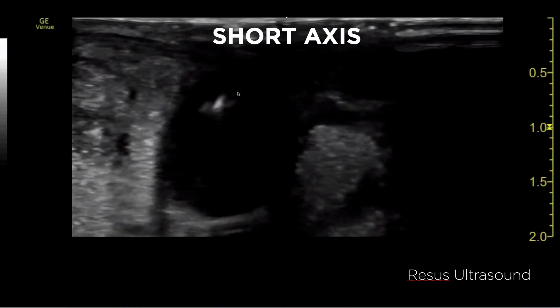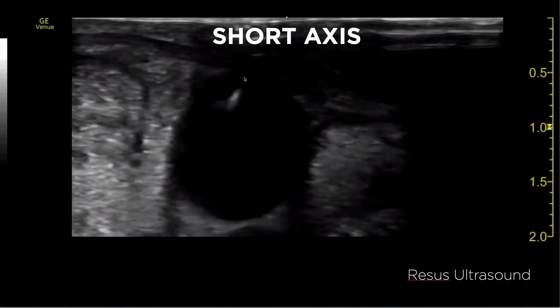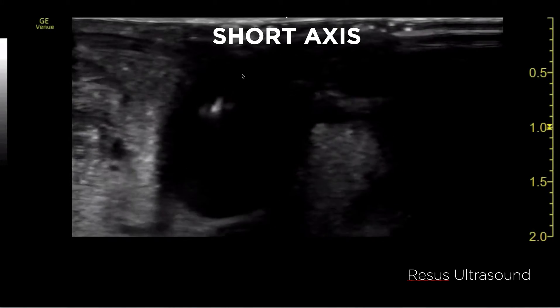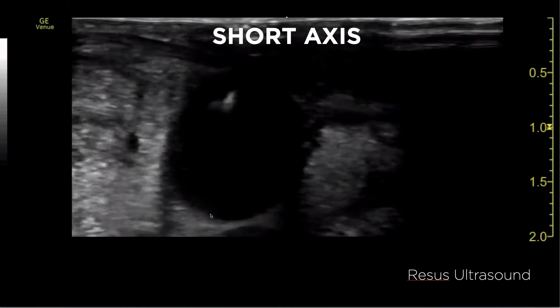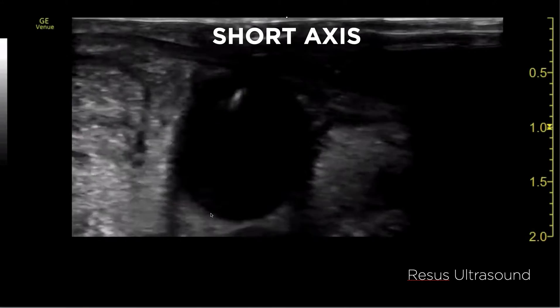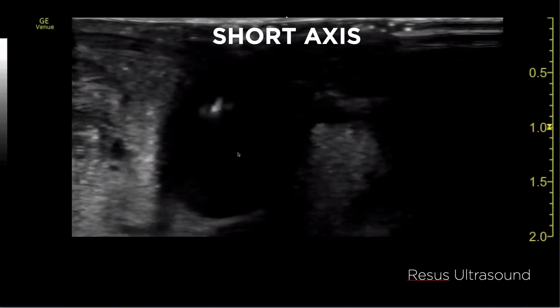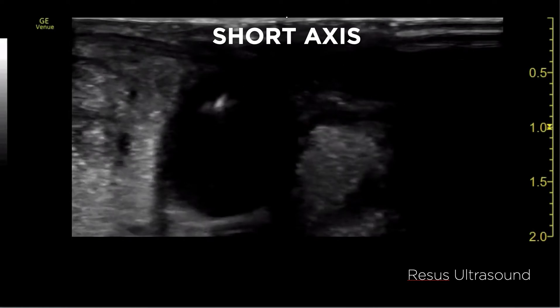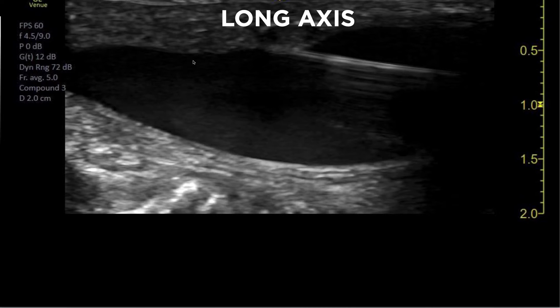So you should see the wire — this is a very short clip, I apologize, but I'll get a better one later. The wire should appear as a bright white structure that falls down to the end of the jugular vein. This view tells you two things: first, the wire is in the jugular vein; second, the wire is probably going to go down to the right atrium.